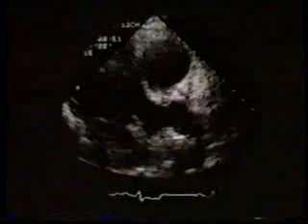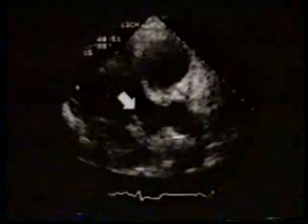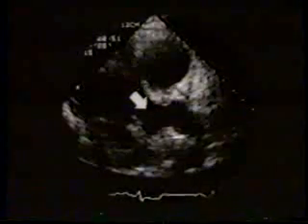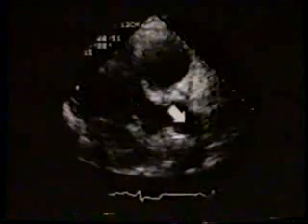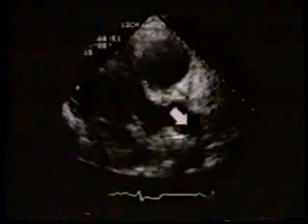This is the magnified view of the same scan. Here's the right atrium. You can clearly see the communication between the right atrium and the pulmonary artery, which is widely patent here. This is proximal right pulmonary artery and left pulmonary artery in this position. Observe this in real time again. Color flow examination confirms the unobstructed flow into the pulmonary arteries.